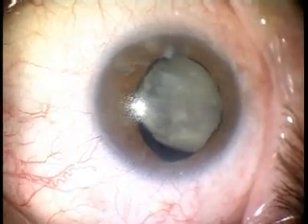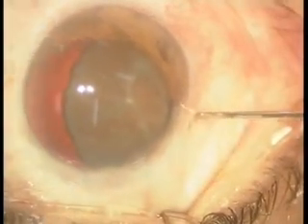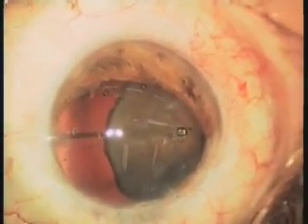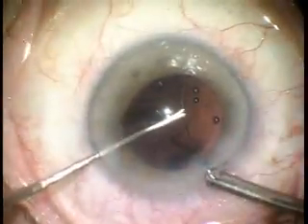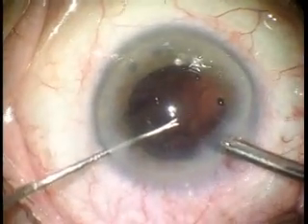Different surgical alternatives can be used in moderate to severe zonular dialysis. The surgeon can use iris hooks to temporarily support the capsular bag. Relatively small zonular defects usually allow for preservation of the capsular bag after implantation of conventional capsular tension rings.